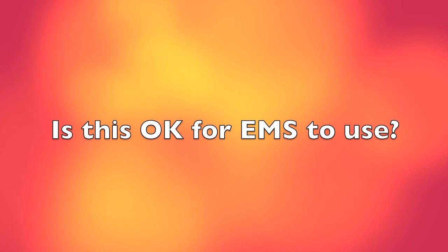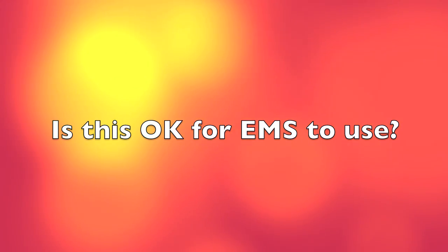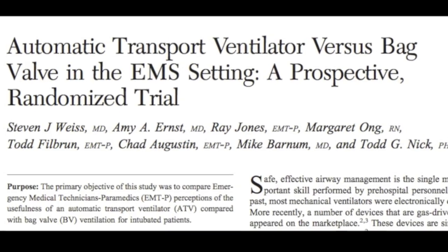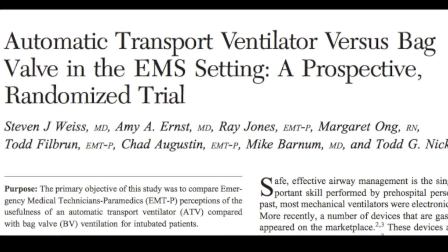Ventilators like the Surevent are used regularly by agencies all over the country for both emergency and non-emergency transports. Use of the Surevent by EMS has been studied and validated.